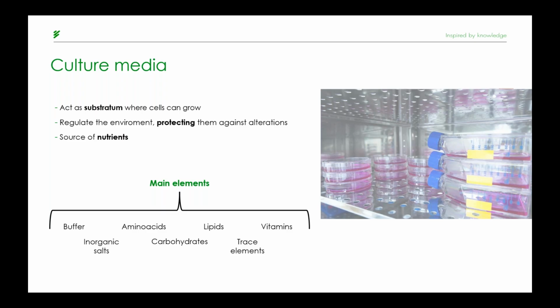All of these requirements are given by the culture media, this liquid solution with all the factors and nutrients to stimulate the growth and the synthesis of products of biological drugs. The main elements of this culture media are the ones we can see here.